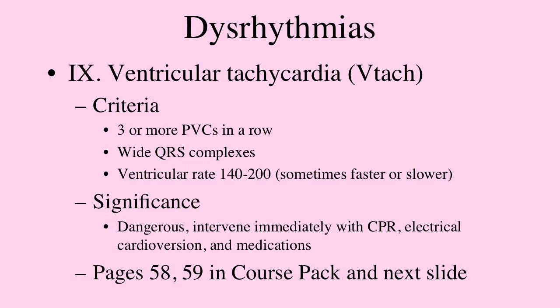If you look at page 58 and 59, you see a lot of examples of VTAC. On the top of 58 you have somebody going along normally, and then there's a run of VTAC, wide. The middle one has that real fast run in the middle, and then some below that shows it, and then page 59, those examples.